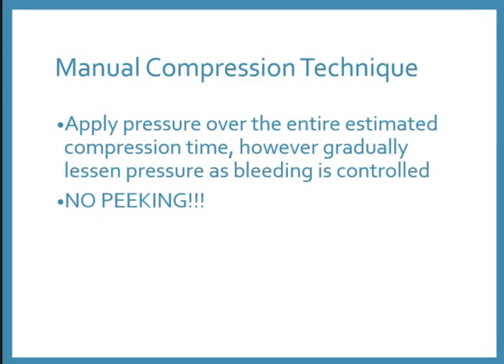They don't recommend peeking. They say no peeking. Make sure that you apply pressure the whole time, the whole 30 minutes. If you're peeking so much that it's every couple of minutes, then you're peeking more than you're holding pressure.